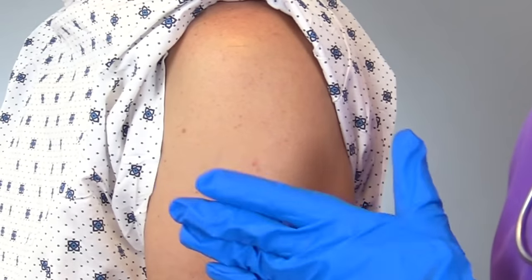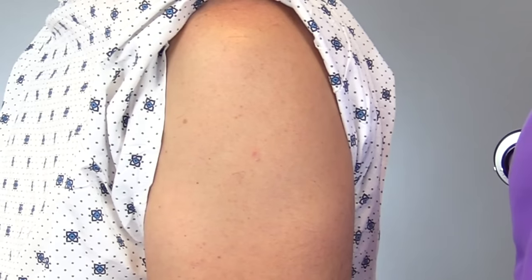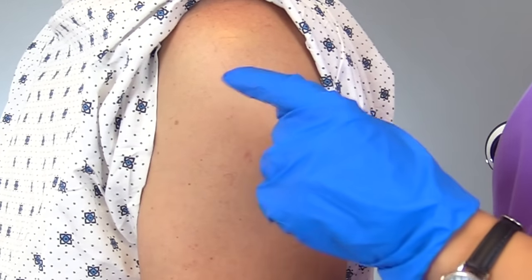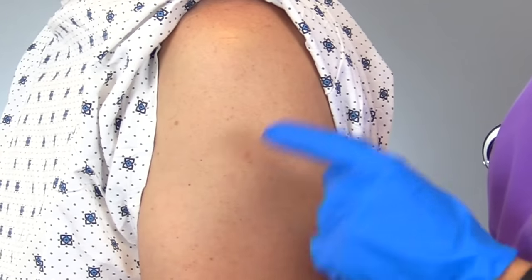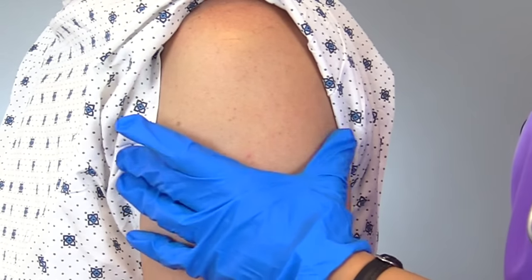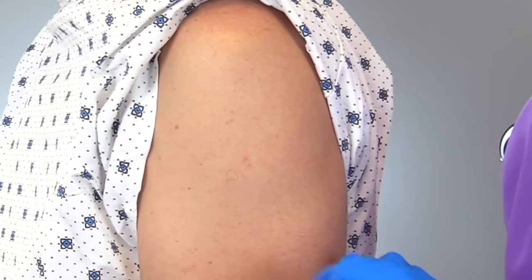To give the injection, we're going to use what's called the Z-Track technique. This is now recommended for all IM injections. It decreases pain for the patient and helps prevent the solution from going into the sub-Q tissue — we want this to go into the muscle, not the sub-Q tissue. Back in the day they taught to pinch the skin up and bunch it to give the vaccine, but that's no longer recommended. The Z-Track method is now standard.